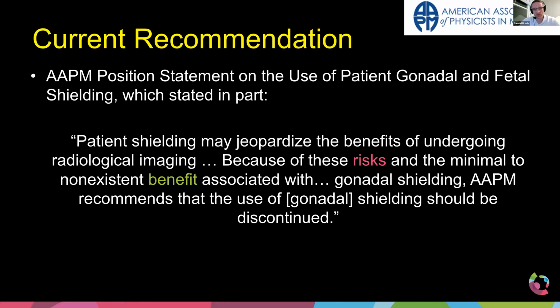So a couple of years ago, there were a couple of papers that came out. A gentleman that I work with here at Cincinnati Children's, he and a couple of his colleagues wrote a paper saying that we don't need to use gonadal shielding. And from that time forward, myself and a handful of other people started looking at this, and a group within the AAPM came up with a position statement. I was actually part of this when they wrote it. It's, I think, about 2 years old now.